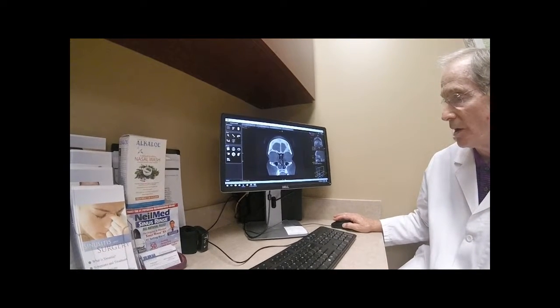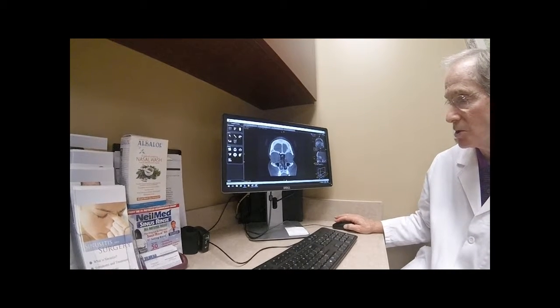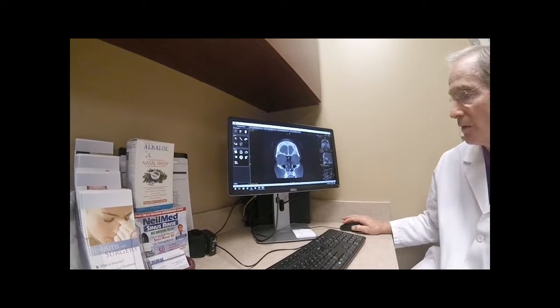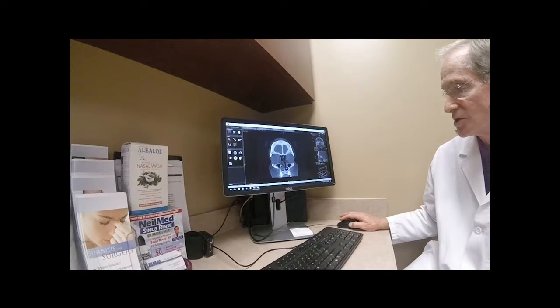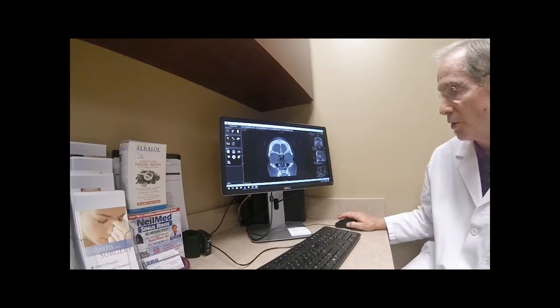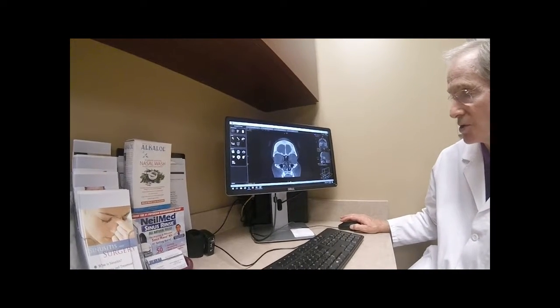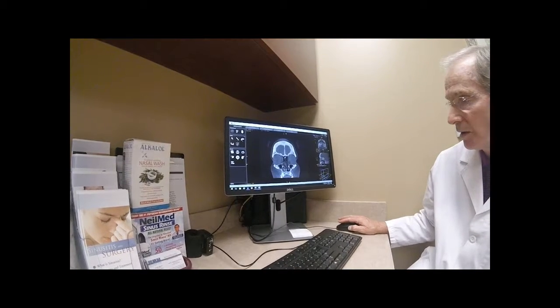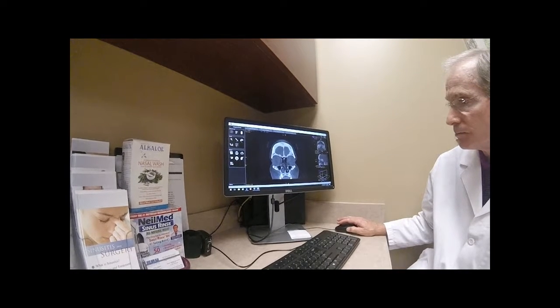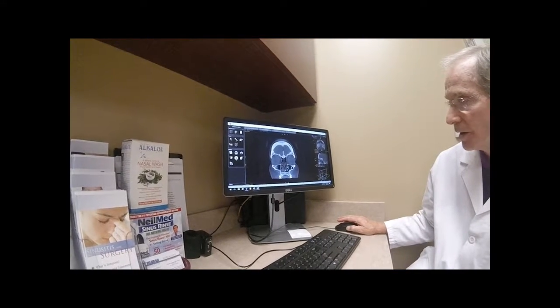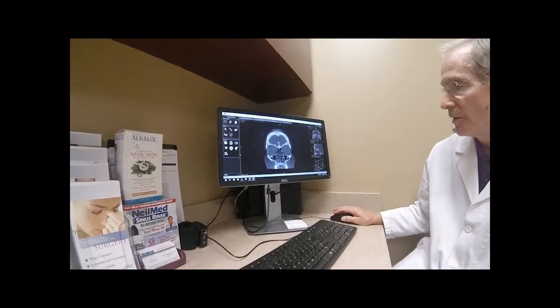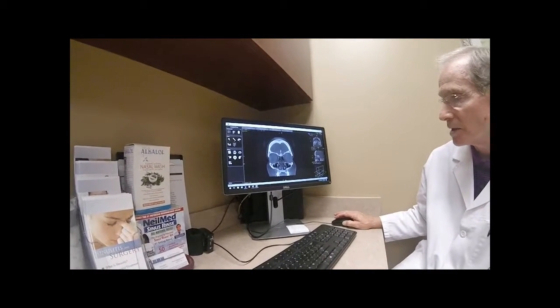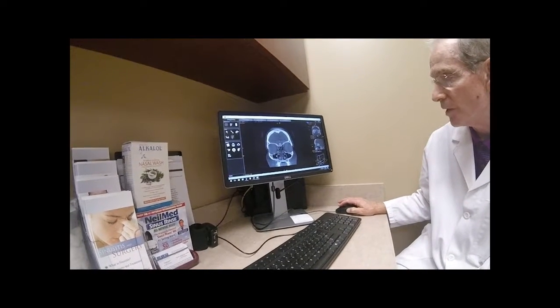At this point the turbinate on the right side is much larger than the one on the left, which can be a natural occurrence. Our nose tends to switch sides by shunting blood flow from one side to the other, which is called a nasal cycle, and that is normal. You probably notice that when you sleep on one side the side that's down becomes more congested, while the side that is up opens up — that's from these turbinates engorging with blood from gravity. The nasal septum has a slight bend here but is mostly in a midline position. As we scroll back, the ethmoid sinuses remain clear and open. There is persistent swelling inside the right maxillary sinus, and we're going to find the drainage duct soon.